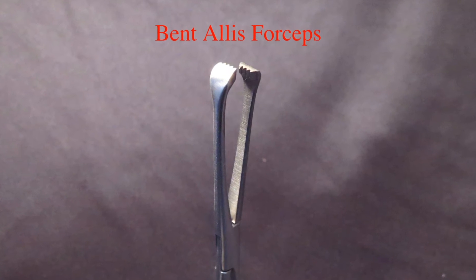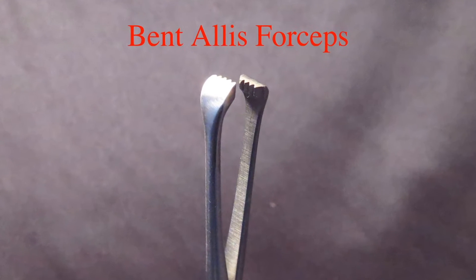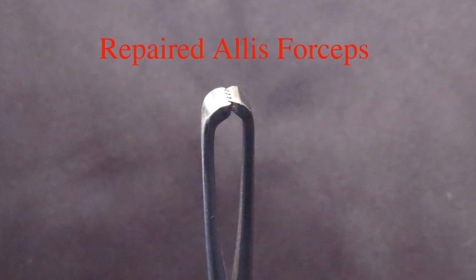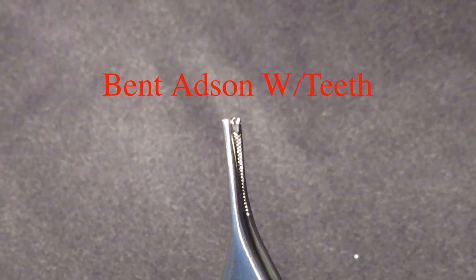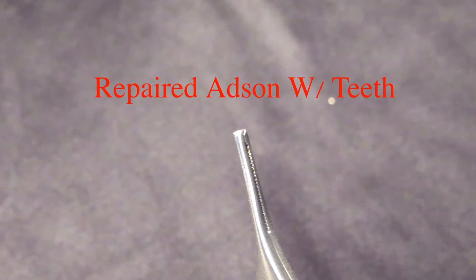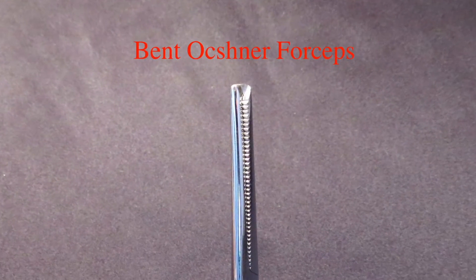You will also be instructed on the use of specifically designed equipment and tools needed to perform these repairs. It is important that you understand how these instruments work and the names of the different parts of each instrument. Although these repairs are relatively simple, the techniques used are specific and the attention to detail is important.